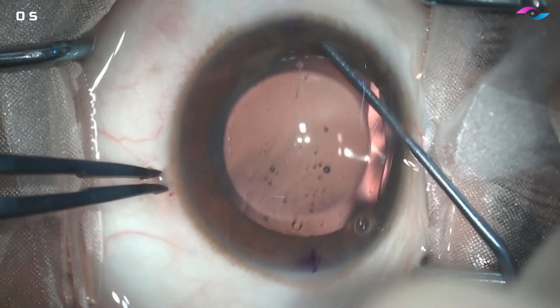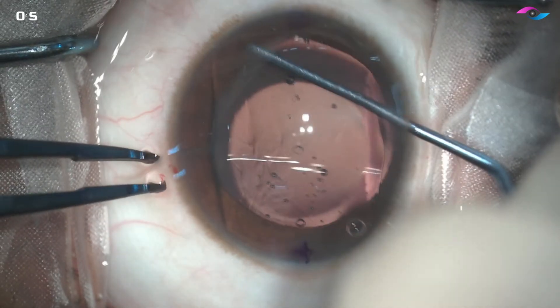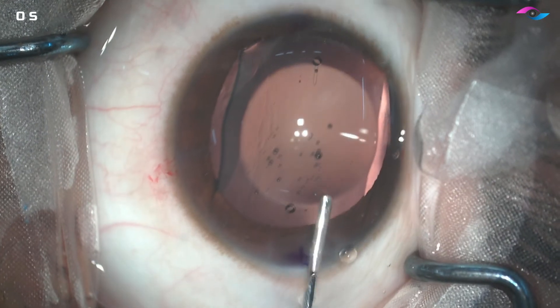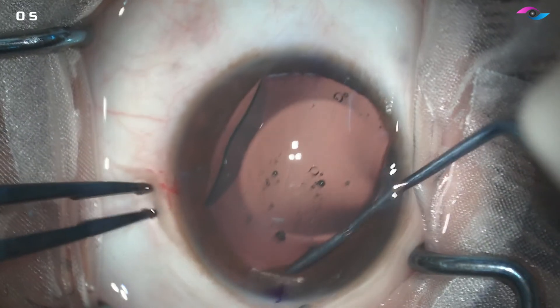Inject slowly and keep observing how the lens is opening up inside the eye. Then we use the iris tucker instrument to gently tuck the ICL haptics under the iris. All four haptics must be tucked under the iris.